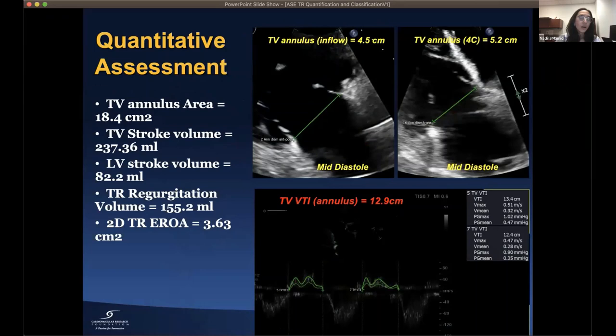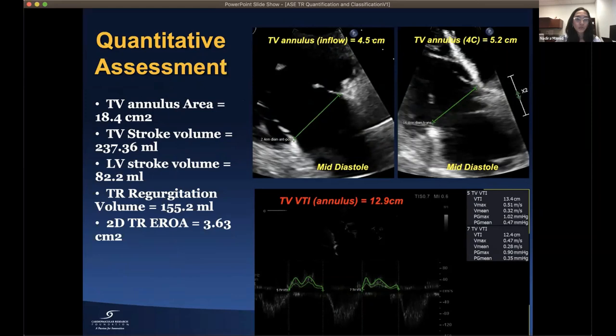For 2D quantitative assessment in this same case, annular diameters from RV inflow and RV focus views yield a tricuspid valve annulus area of 18.4 cm². Multiplied by pulse wave VTI at the annulus gives a stroke volume of 237.4 mL. Subtracting the forward stroke volume yields a TR regurgitation volume of 155 mL. Dividing by TR VTI gives a 2D EROA of 3.63 cm², consistent with torrential tricuspid regurgitation.